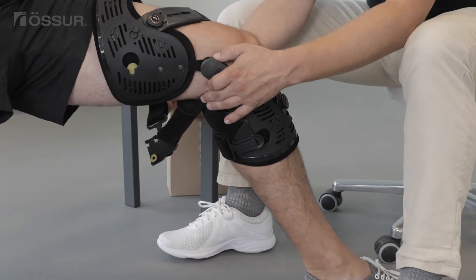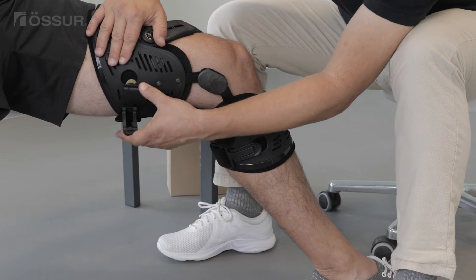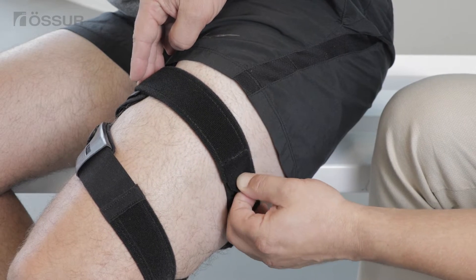Bend the patient's knee to an 80 degree angle. Place the button of the yellow quick fit buckle into the yellow keyhole and close. Use the alligator clip to get an appropriate snug fit of the thigh strap.